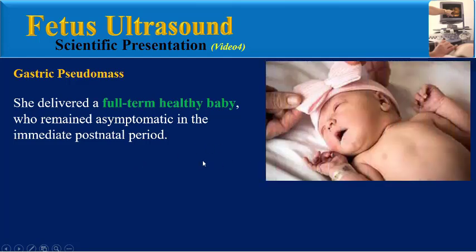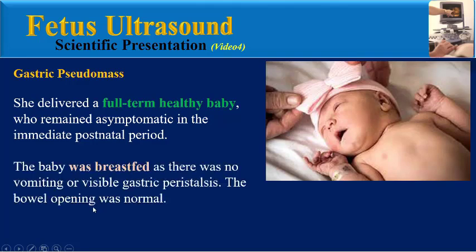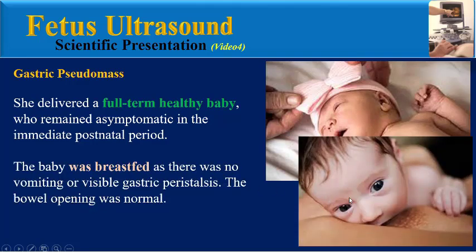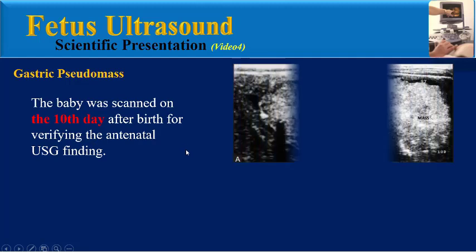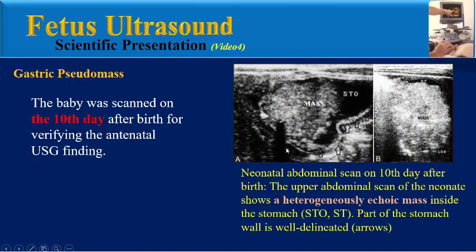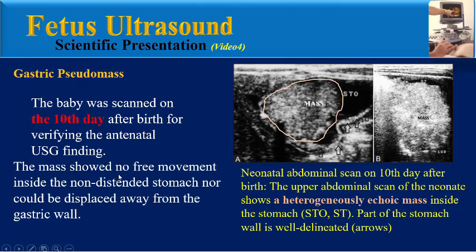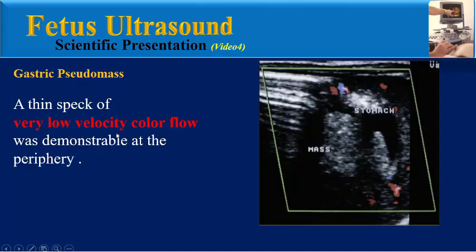She delivered a full-term healthy baby who remained asymptomatic in the immediate postnatal period. The baby was breast-fed as there was no vomiting or visible gastric peristalsis. The bowel opening was normal. The baby was scanned on the 10th day after birth for verifying the antenatal ultrasound finding. As we can see in this abdominal ultrasound scan on the 10th day after birth, a heterogeneously echoic mass inside the stomach. The mass showed no free movement inside the non-distended stomach, nor could it be displaced away from the gastric wall.